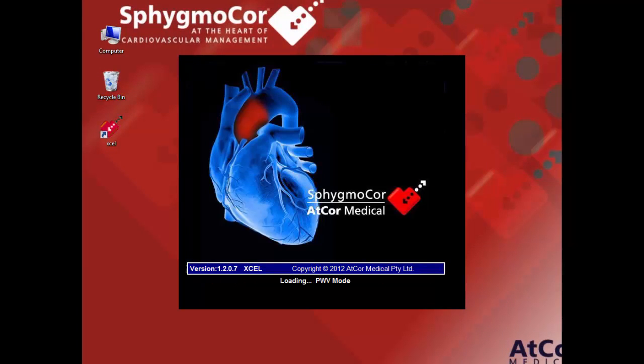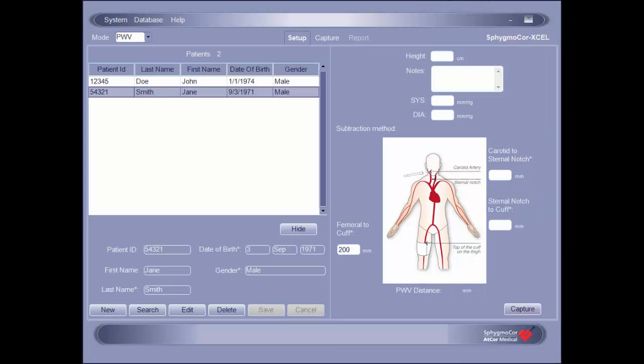To get started, on your computer desktop double-click the SphigmaCore XL icon to launch the application. To establish communication between the software and the SphigmaCore XL module, click on System in the upper left corner of the toolbar and select Find Module from the drop-down menu. If communication has been successfully established, a message stating 'electronics module found' will be displayed in the notification area at the bottom of the screen.